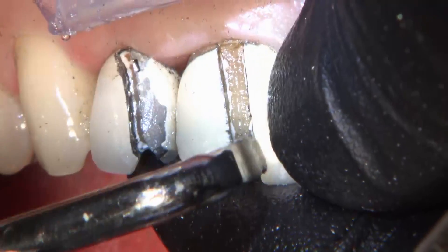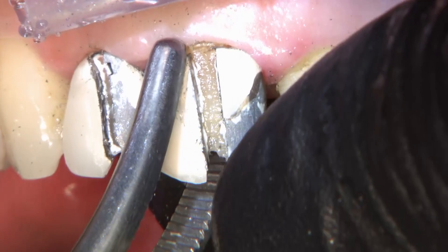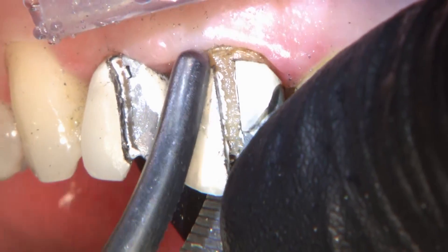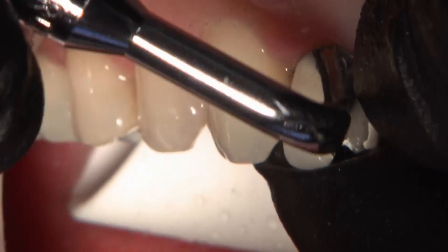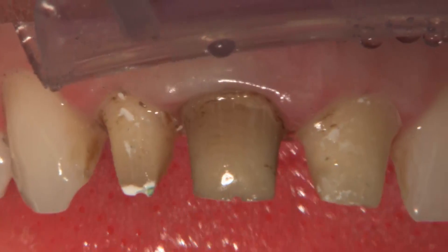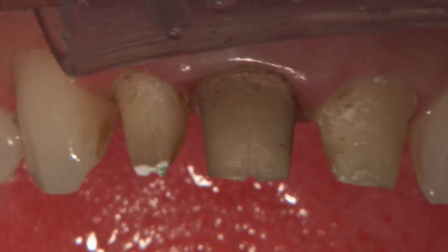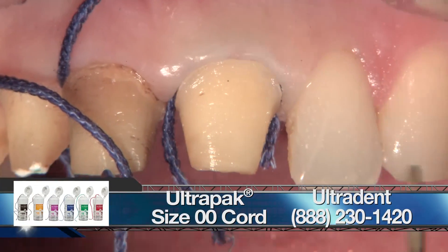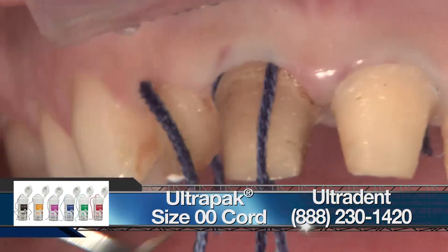I kind of feel sorry for the young dentist growing up today, because most of what they're going to take off is going to be monolithic restorations. They're now 87% of what we do here at the lab — the crowns and bridges we do are solid zirconia and lithium disilicate. So the dentists of tomorrow have a lot of those tough restorations to take off. We're placing a double zero cord here to move the tissue back and help gauge where my margin position is going to be.